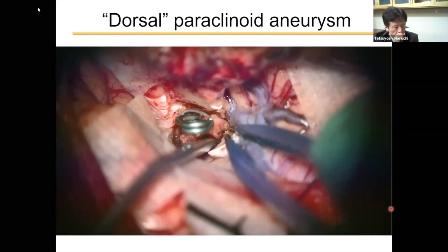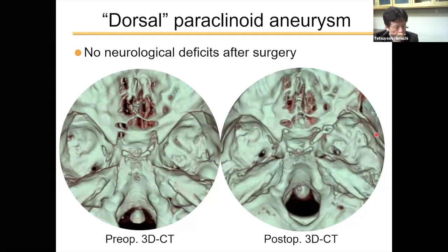Post-operative course was uneventful. And this is post-operative 3D CT showing removal of the anterior clinoid process, and you can see the aneurysm clip. The patient had an allergy against the contrast medium, so there was no angiogram postoperatively.